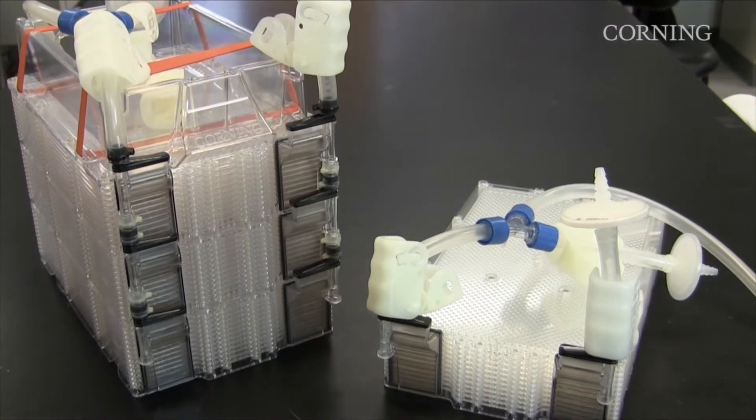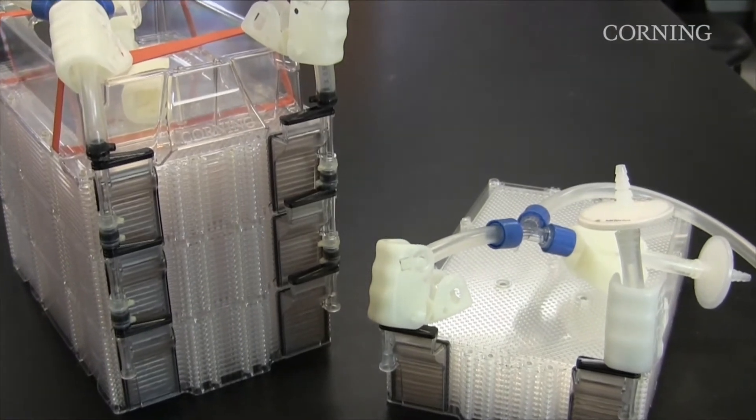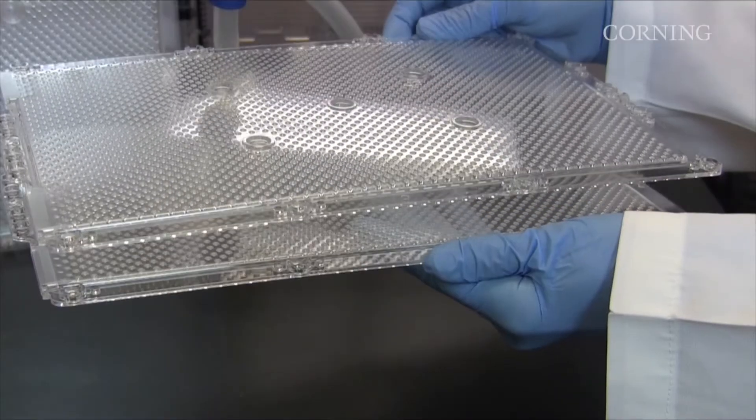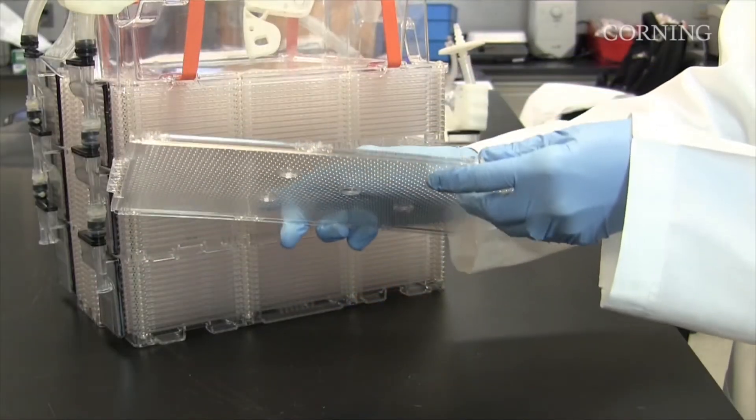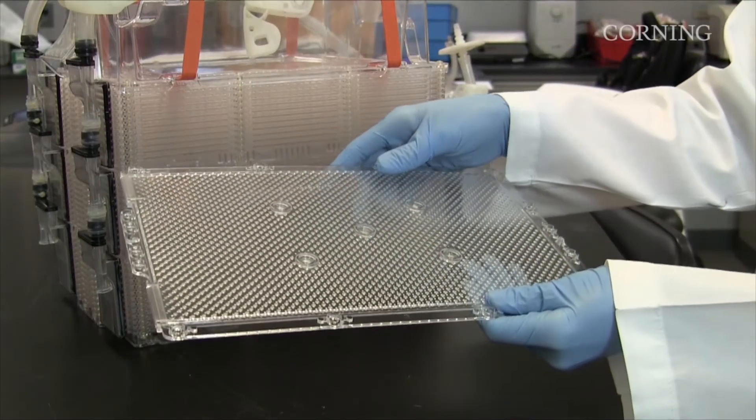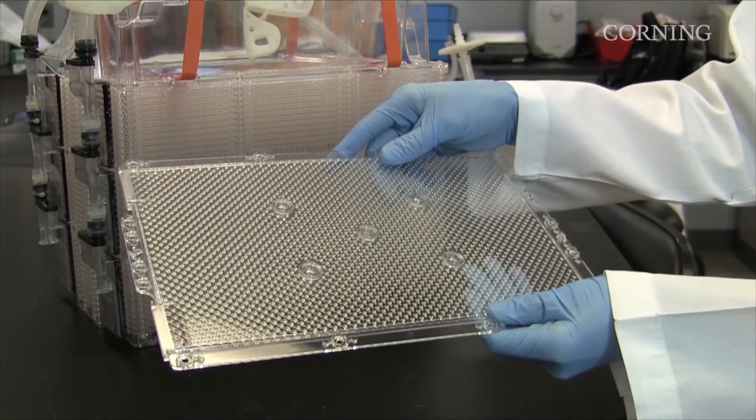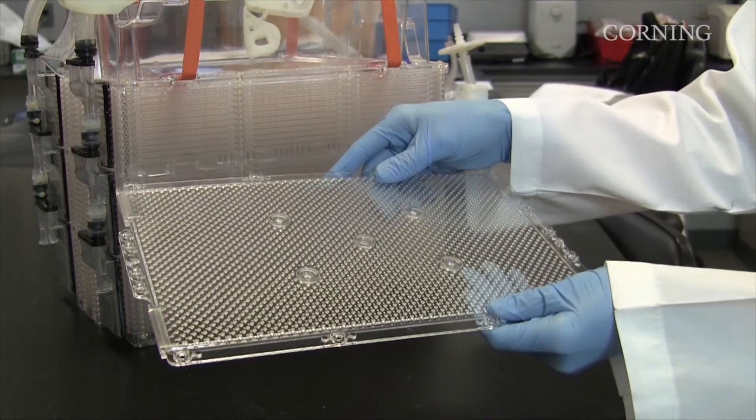Before we demonstrate the procedure, let's review the components of the HyperStack vessel. The stackette is the individual cell culture chamber. It is comprised of a top plate and gas-permeable film. Each stackette has a total of 500 square centimeters of growth area.